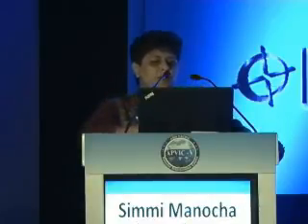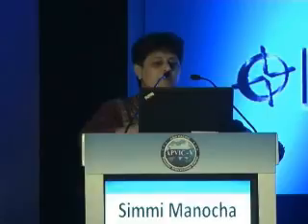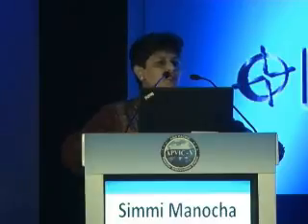Then there are buttons for image optimization control. We can change the frequency of the probe. These buttons can help us in changing the resolution of the machine and the penetration, or generally optimize between the resolution and penetration depending upon the work we want to do. If we opt for best resolution, then we need a higher frequency. If we opt for best penetration, then lower frequency probes are to be used.